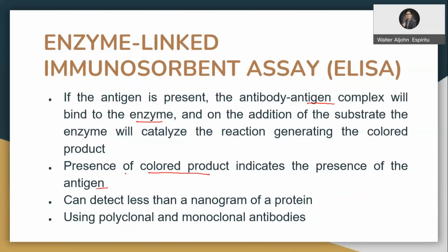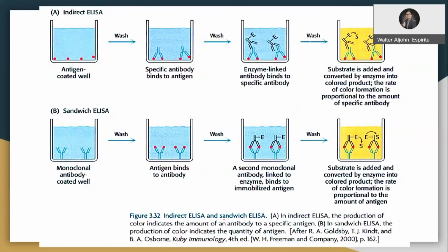This may use polyclonal or monoclonal antibodies, which are produced by multiple cells or a single cell, B cell to be specific.